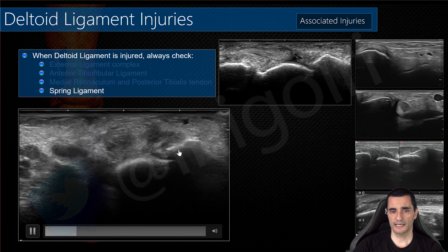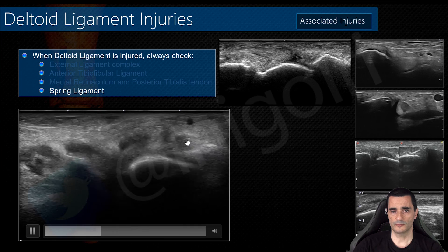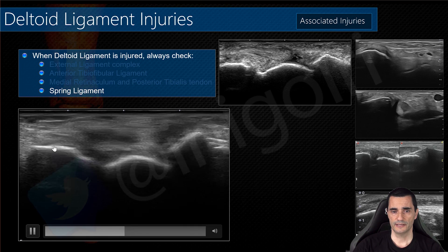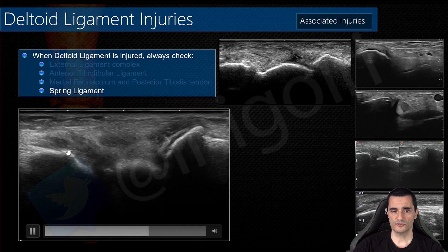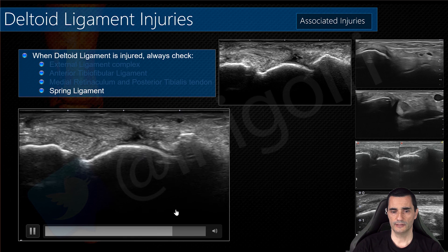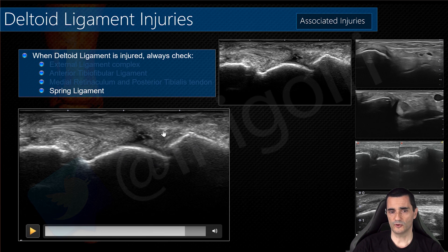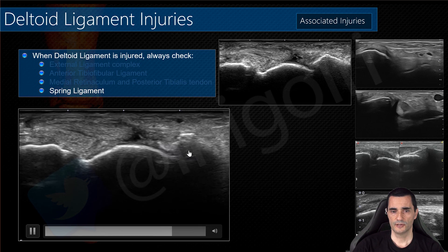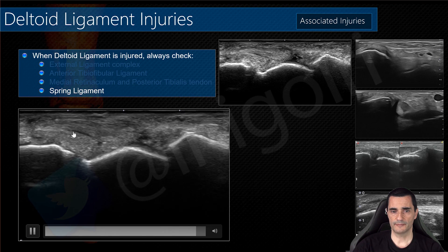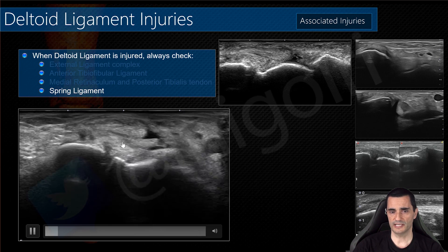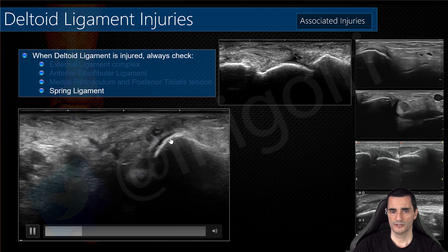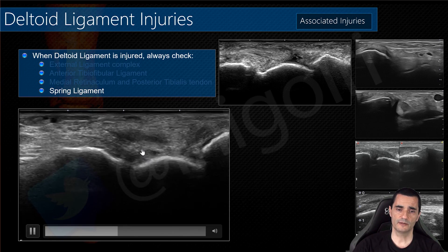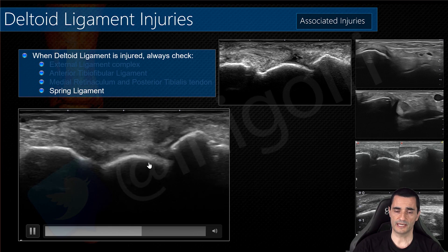We reach its insertion at the navicular bone, and we observe it traveling between the three bones — the sustentaculum tali, the head of the talus, and the navicular bone. You can notice that the posterior tibialis lies directly over the head of the talus because there is no spring ligament — no superomedial spring ligament — present here. This represents a total rupture of the superomedial component of the spring ligament.